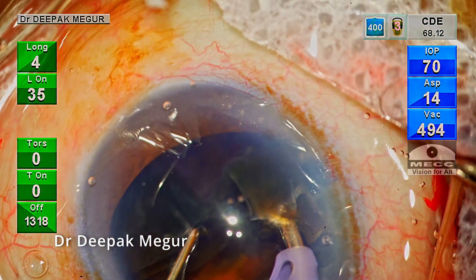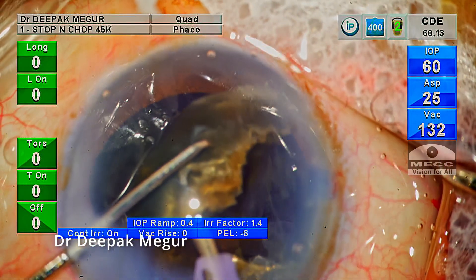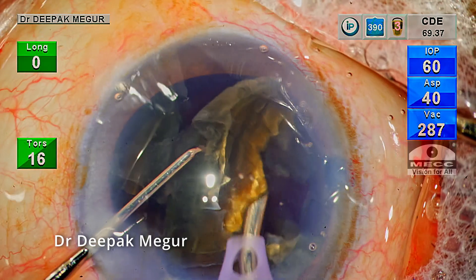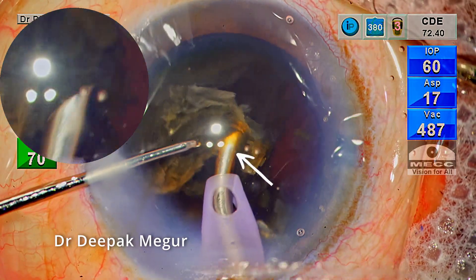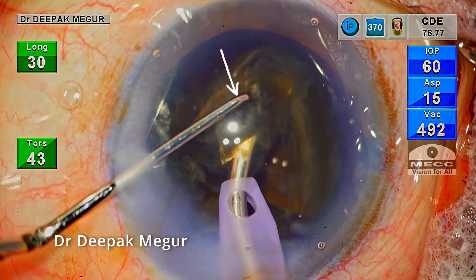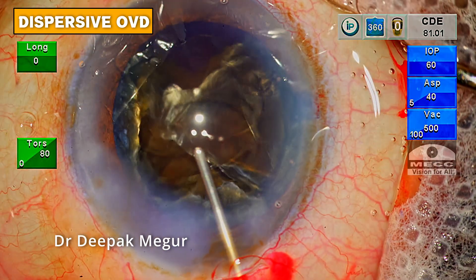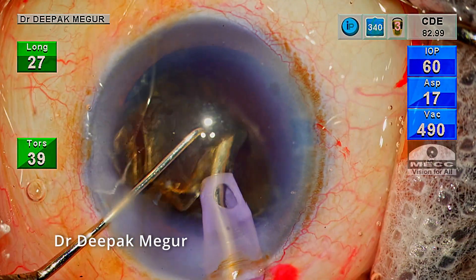At this point, one fragment has become free and escaped out of the bag into the anterior chamber — it's quite close to the cornea. But luckily, as we recollect, the chamber was deep in this patient, which is going to be beneficial. I switch my settings to the quadrant removal mode and will be using continuous torsional energy to emulsify this fragment. Please note the position of the bevel: it is turned sideways and facing the fragment so that the maximum amount of tip is exposed. The second instrument is held above the fragment acting as a guard, preventing any part of the fragment from flying around. The fragment was consumed eventually.